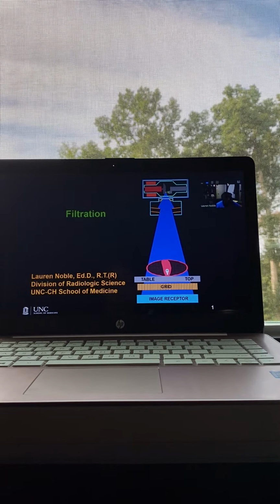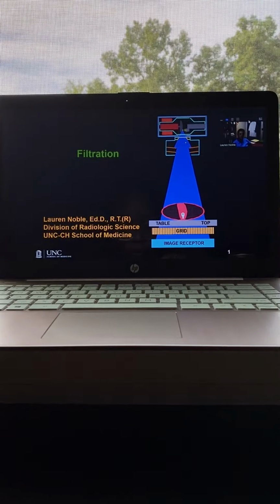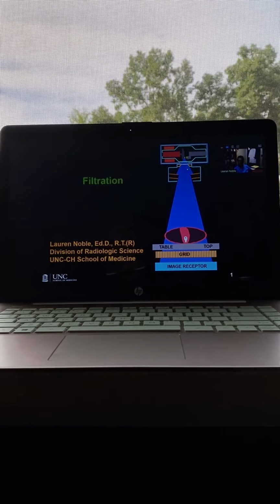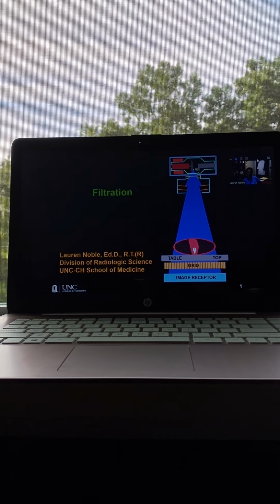But just as a quick little overview, we talked about the X-ray tube last semester, right? This past summer. So just as a little overview, are you able to see the mouse, the arrow? Okay, good deal. So at this end of the X-ray tube, what two components do we have here? Filament and focusing cup. Right, filament and the focusing cup. And remember, the focusing cup was made of nickel. And the filament, the primary element, is tungsten.